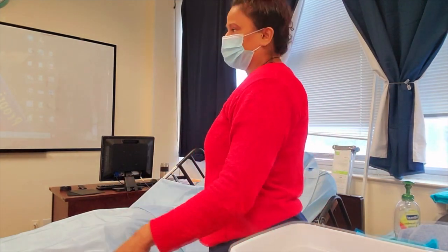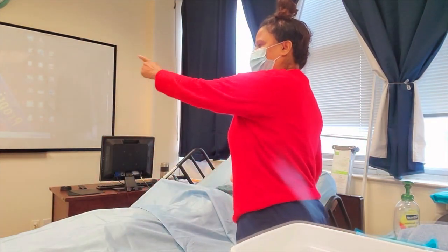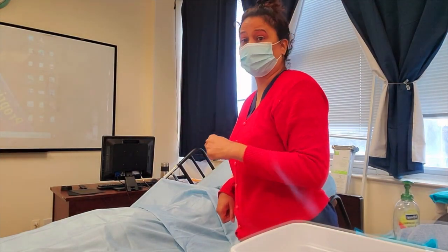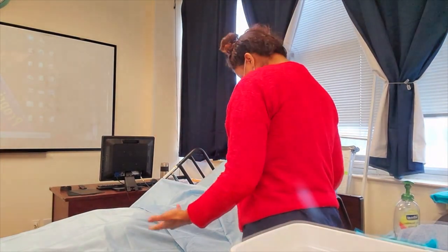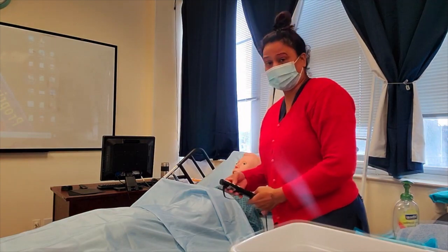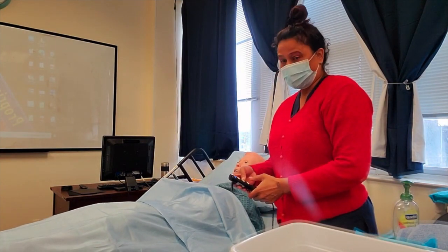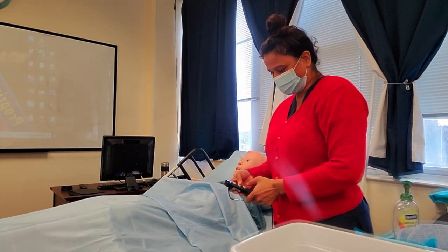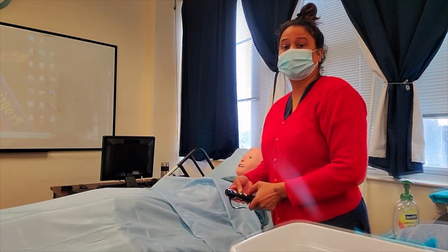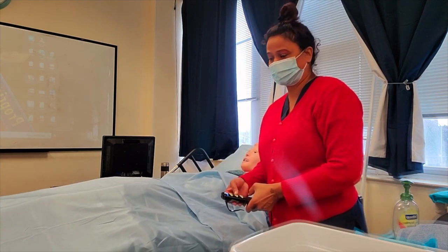The next thing is to lock the bed. Make sure your bed is locked, your privacy curtain is pulled, and raise your bed to working level. Why do you raise the bed to working level? Because you want to maintain proper body mechanics to prevent back injuries.